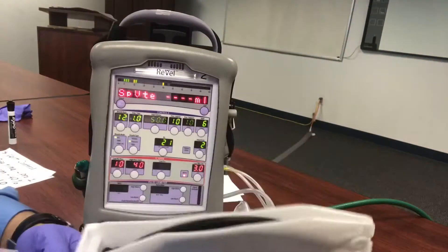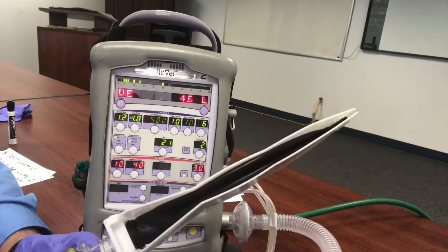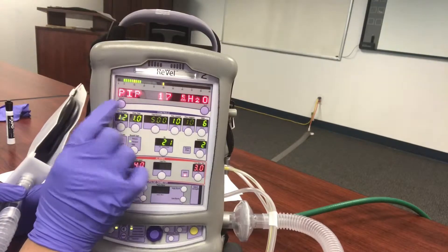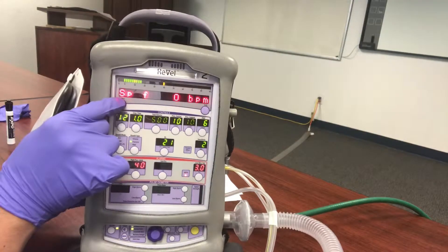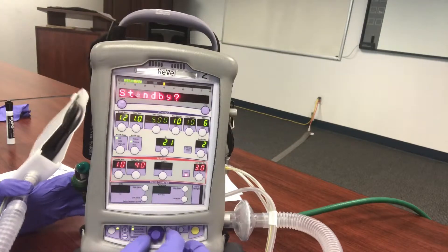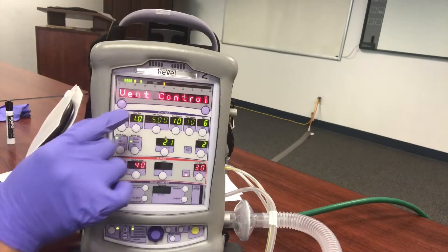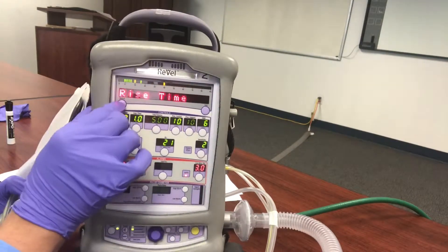We'll select Ventilate, so now we're in our NPPV mode. If you were to put this on the patient right now, they probably wouldn't be very comfortable because it blasts that first breath. So we need to make a couple of adjustments. Let's go into the submenu — hold down Select — and it'll bring us into the submenu. We'll scroll past Standby, SVT, Nebulizer, Alarm Config, and go to Vent Control. This is where we'll make our first adjustment — select, then select Rise Time.